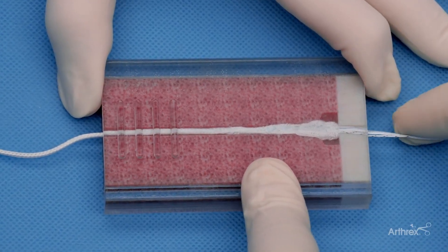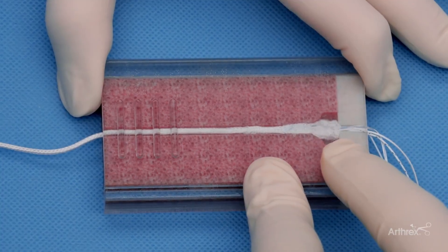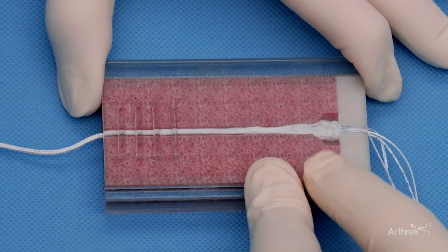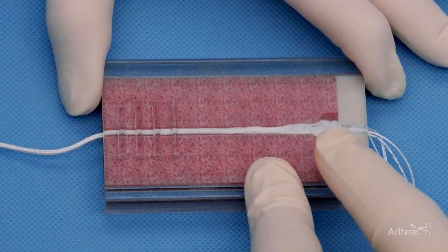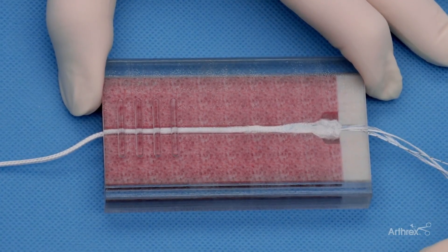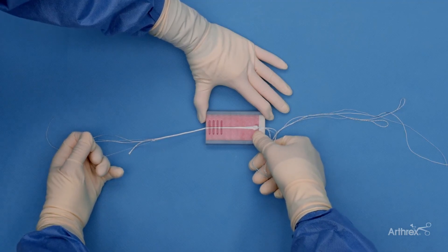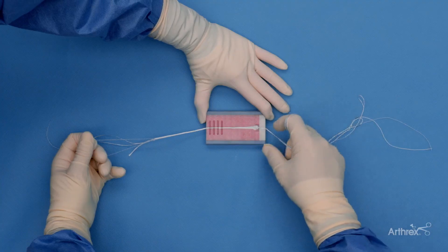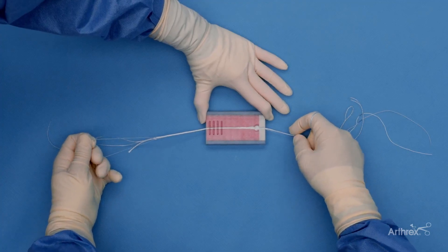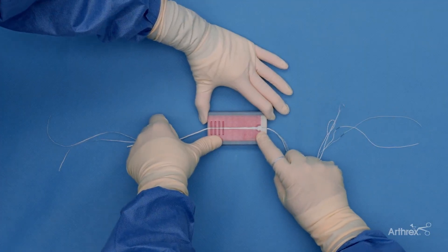The first thing to do is to pull the four suture limbs and gently set the sheath. You can see that the sheath bunches up right under the tibia cortex, and because of the unique nature of the design of the sheath, it does not come back through the tibia but securely holds right under the tibia cortex. In order to fully deploy the sheath, you take the meniscal SutureLock sheath setting suture — this one with a loop — and pull it back to ensure that the sheath is fully bunched up. You gently toggle this back and forth until it is fully deployed and cinched up securely right against the tibia cortex.